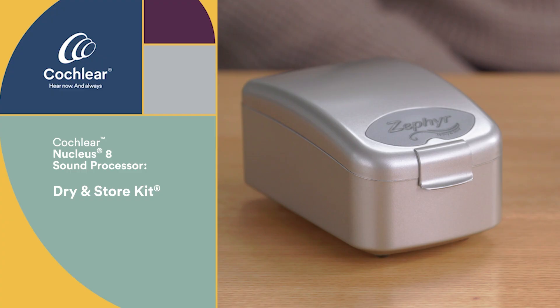This is the dry-n-store kit. You'll use this each night to dry your processor to keep it operating efficiently. The maintenance video will provide additional instructions on how to get the device set up correctly for the first use.